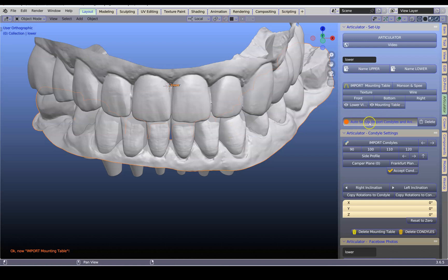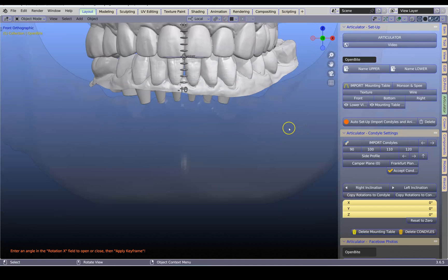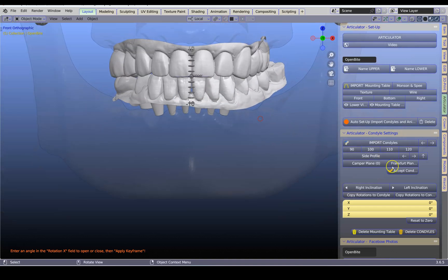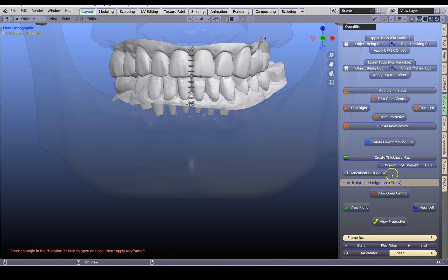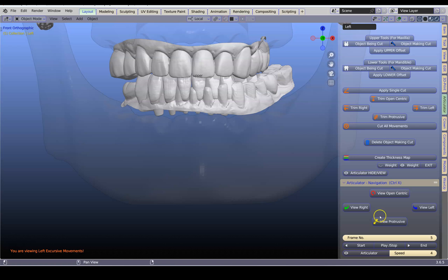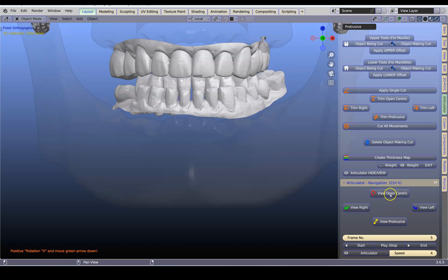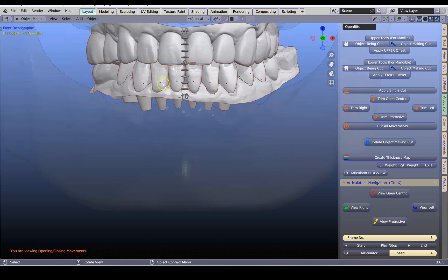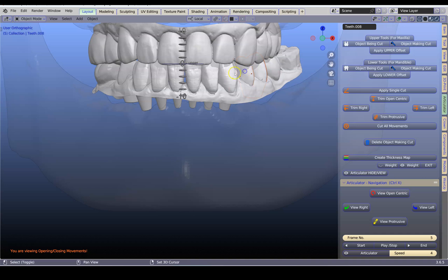Now after you've done this we will see that it has been animated. The teeth, though, will not be animated — just watch as I go on the lower side. It is clear that the tooth library is not animated. Now select all of your teeth and then we're going to link those to the animation.